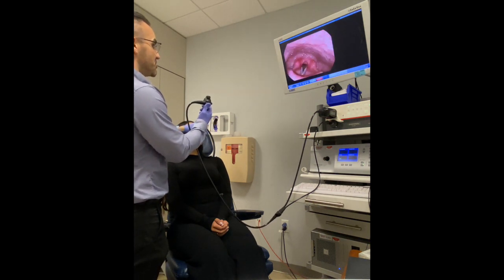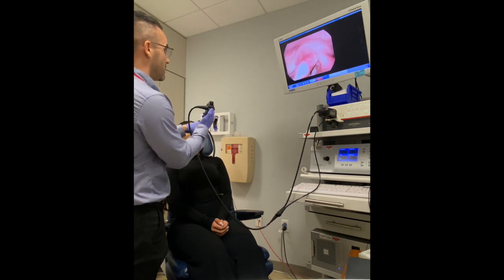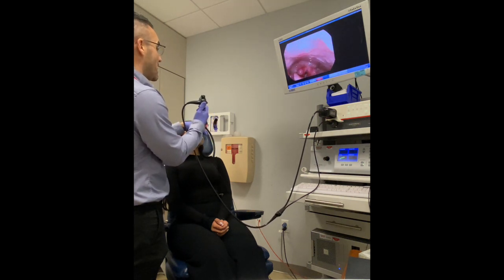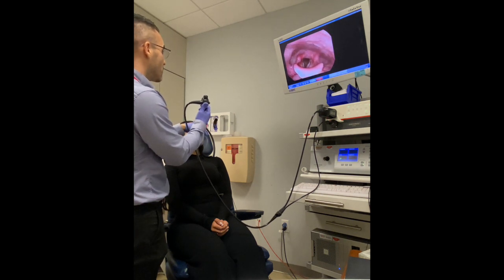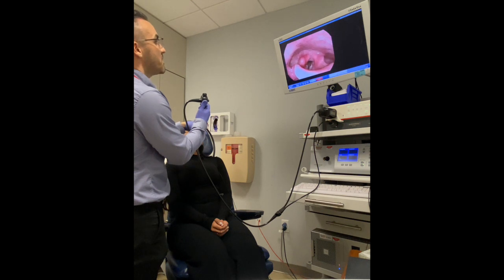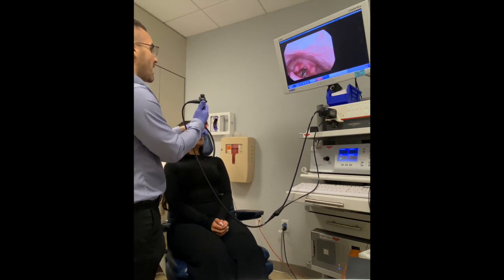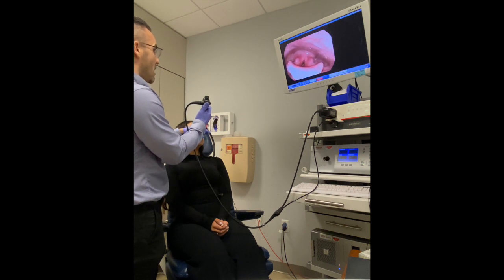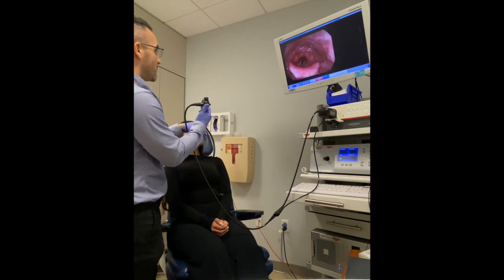One of the things we were seeing in your previous swallowing evaluation is that food and liquid is oftentimes going into your voice box before you swallow. Your voice box includes those vocal folds, attached to those balls of cartilage — those are what actually move your vocal folds. We have this half-circular shaped structure in the middle of the screen called your epiglottis; it folds over your voice box to protect your airway when you swallow. Behind the arytenoids is the entrance into your food pipe. We don't want anything in your voice box area — below your vocal folds is your windpipe. If something went down there, that would be what we call aspiration. When it's at your vocal folds or in that little space right above it, that's what we call penetration — it's in a warning zone but it didn't get aspirated yet.